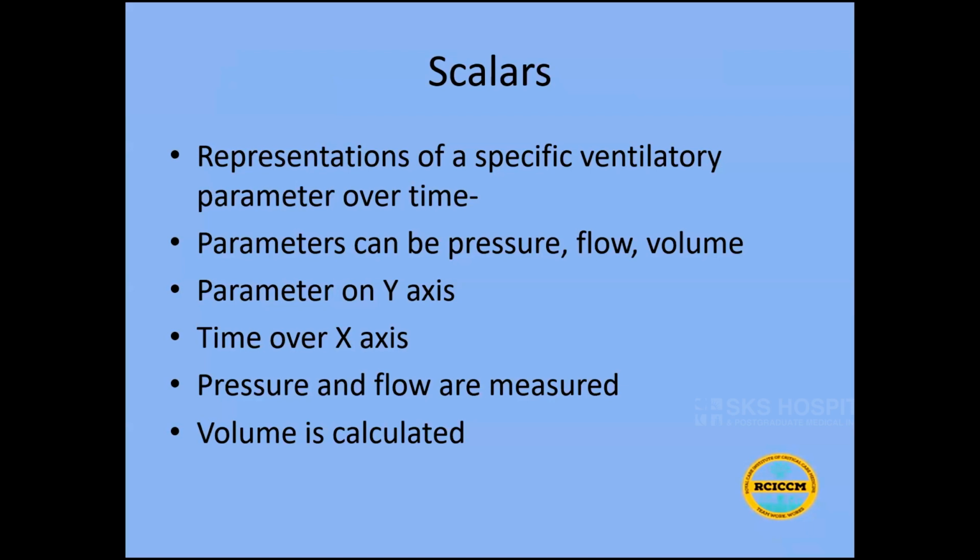For a single mechanical breath, the parameter of pressure can be represented on the y-axis, and how much pressure is being delivered is shown over time on the x-axis. Typically, pressure and flow are measured entities, and volume is a calculated entity. I just want you to be aware of that.